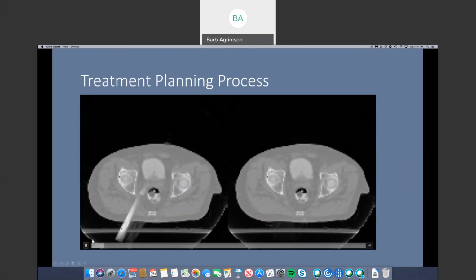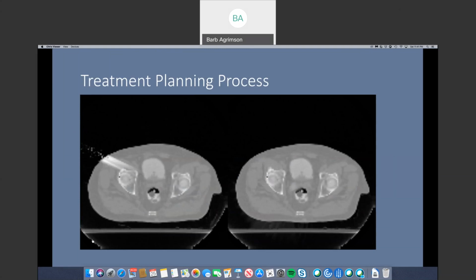This is a visual attempt at showing the dose buildup as the gantry rotates around the patient axis. Notice on the right-hand side image, the accumulation of dose gradually is demonstrated in white. The treatment is termed an ARC technique, and it is a common treatment for centralized tumors such as a prostate. So the gantry is rotating around, and then on the right-hand side, the dose buildup is fully in effect after one full arc of the gantry.